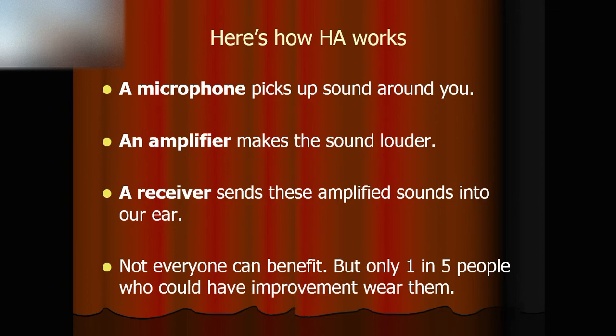So essentially, a hearing aid takes an incoming sound and chops it into different frequency bands. For each frequency band, the hearing aid operates differently. The hearing aid will enhance some bands and some frequencies significantly, while it may just maintain or slightly enhance the other frequencies.